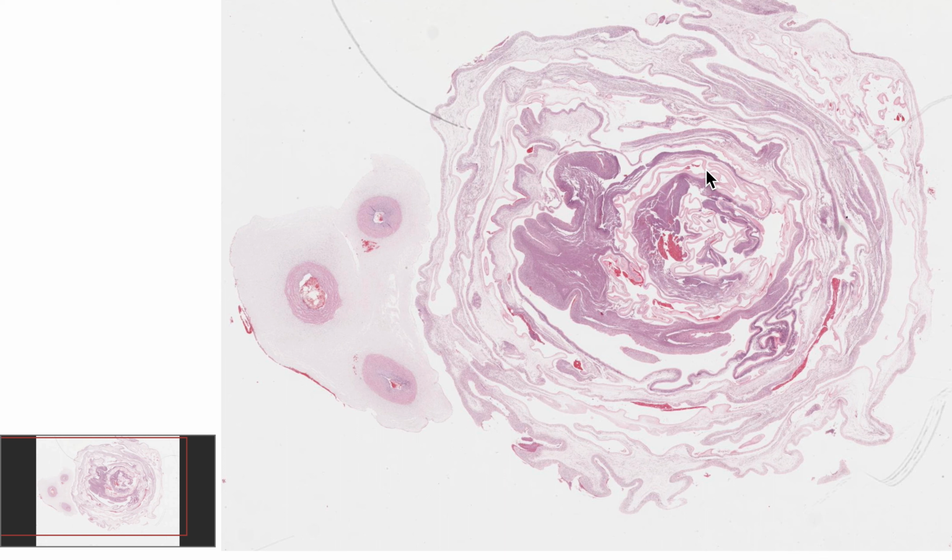So just to recap, we went over what the free membranes are. You have the amnion layer and the chorion layer, and you should have no neutrophils in either area. Otherwise, you have acute chorioamnionitis, which we have here. And then we have the umbilical cord, and you have two umbilical arteries and one umbilical vein, and you can get either acute arteritis or phlebitis, and if neutrophils go to the Wharton's jelly, that's acute funisitis. And this is the baby's response to infection, and chorioamnionitis is the mom's response to infection.